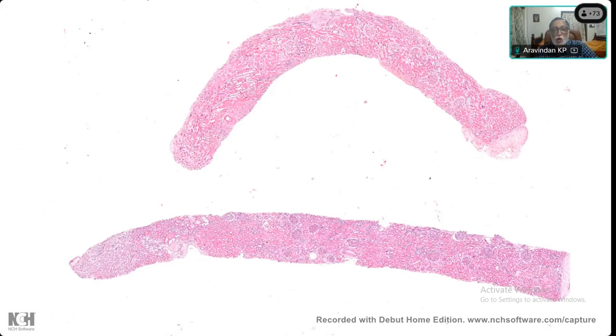What else can you gauge from this picture? We can't see any dark areas, so there might be less inflammation or not much. Otherwise, I would say that this looks pretty clean, no? Yes, sir. Not much inflammation, a clean biopsy.